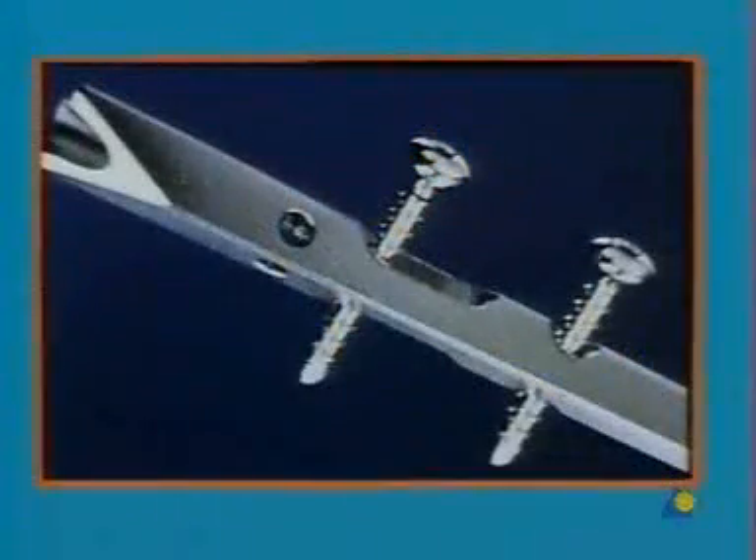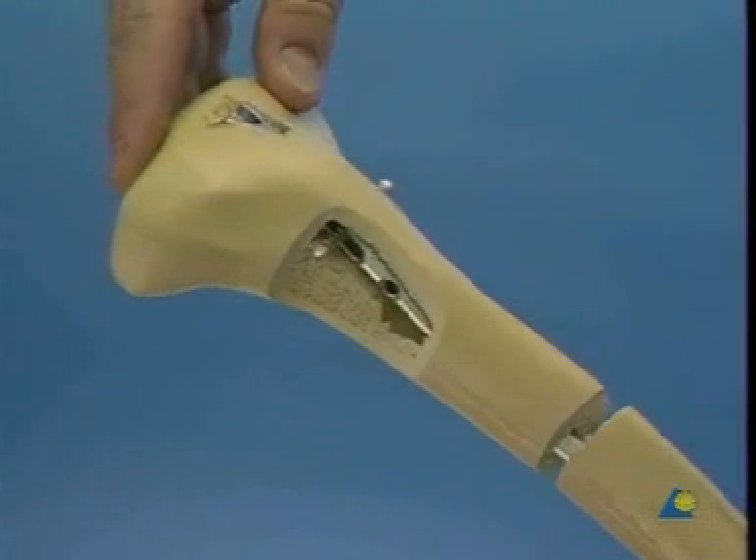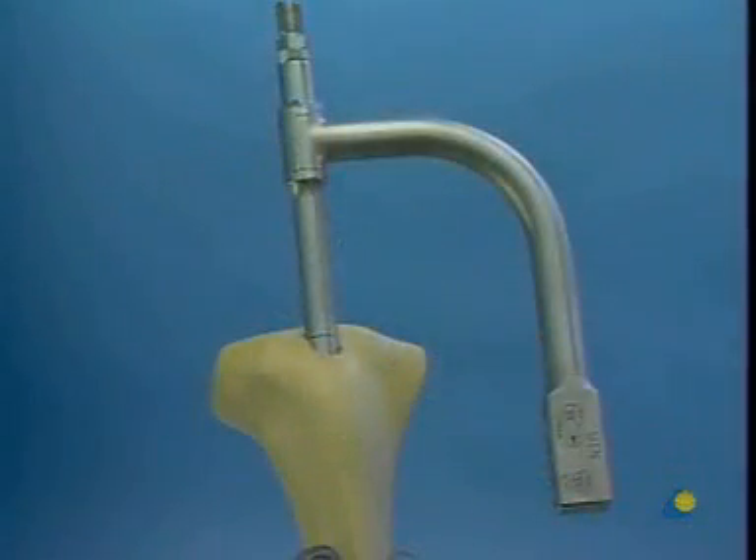There are two methods of locking in the coronal plane suitable for the unreamed tibial nail. If the bone length and its rotation have to be maintained by the nail, static locking must be carried out. If locking is purely to ensure correct rotation of the tibia, dynamic locking is appropriate. Static locking will be shown first.